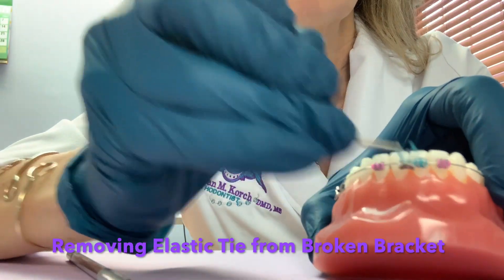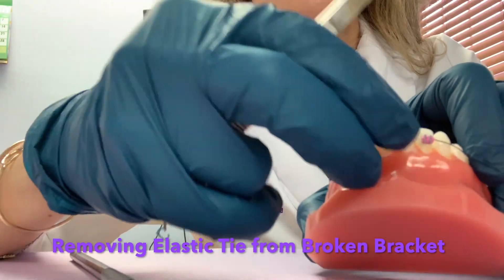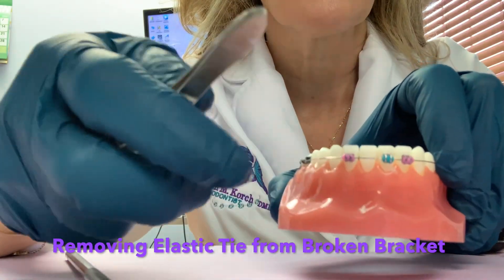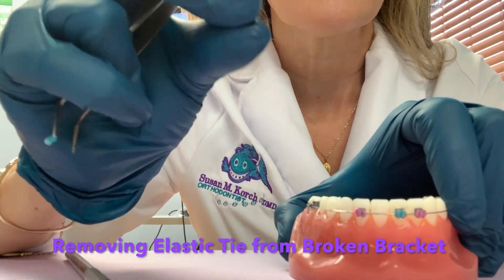Then you can take the little rubber band off with tweezers, and the brace will no longer be attached to the wire. Then you can take the brace out of the mouth.